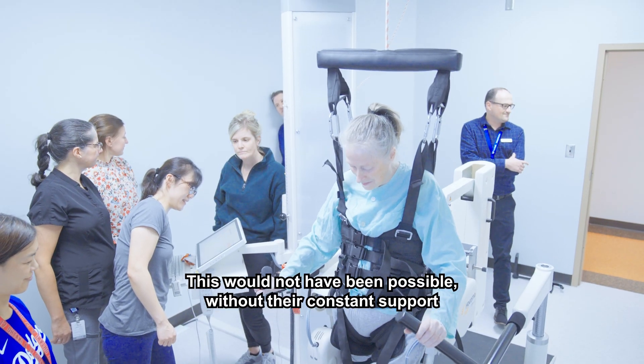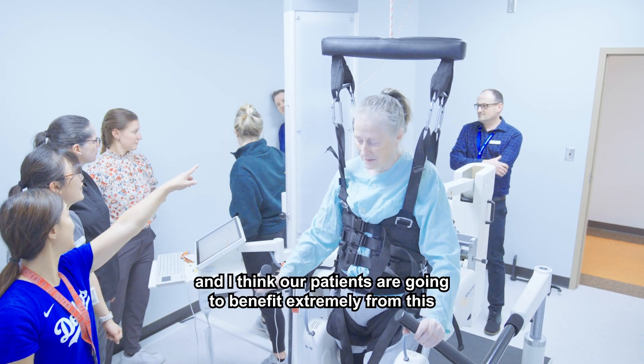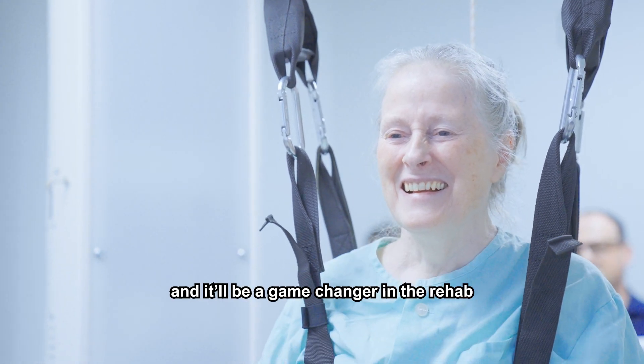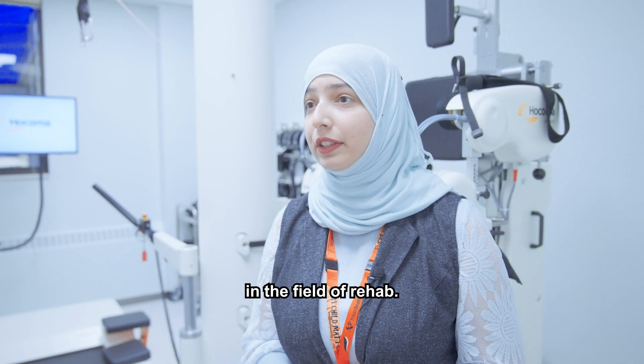This would not have been possible without their constant support, and I think our patients are going to benefit extremely from this. It will be a game changer in the field of rehab.